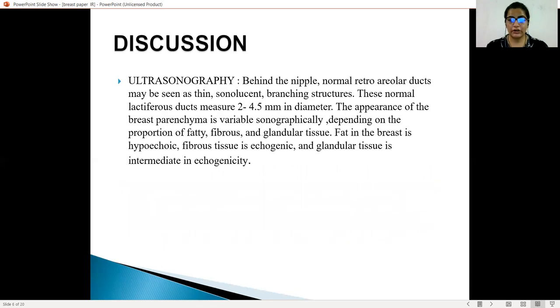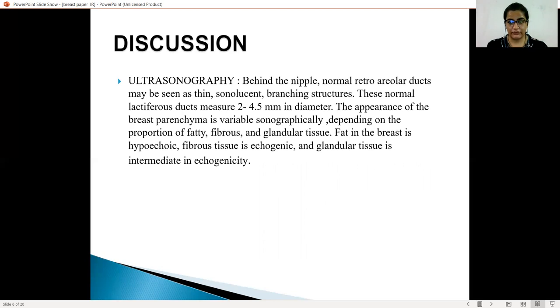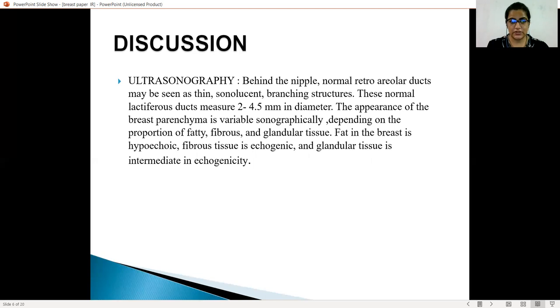In sonography, on a normal scan, normal retroareolar ducts are seen as thin, sonolucent branching structures. These are lactiferous structures which measure 2 to 4.5 millimeters in diameter. The appearance of breast parenchyma is variable sonographically and depends upon the composition of the fatty, fibrous, and glandular tissue. The fat in the breast is hypoechoic, the fibrous tissue is echogenic, and the glandular tissue is intermediate in echogenicity.